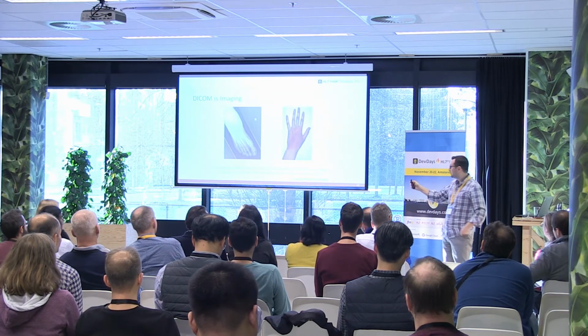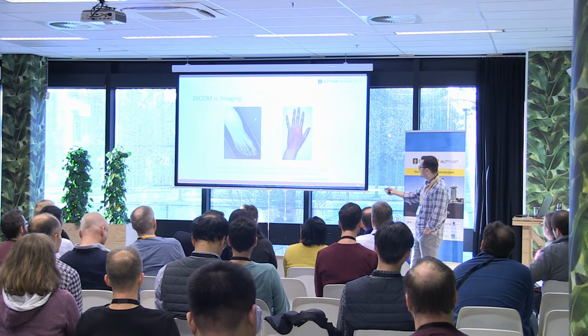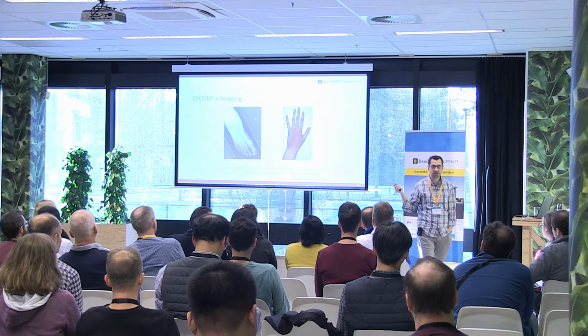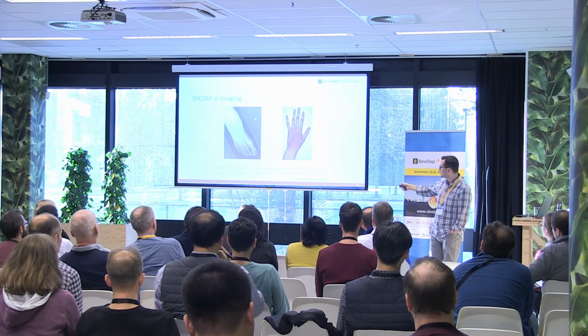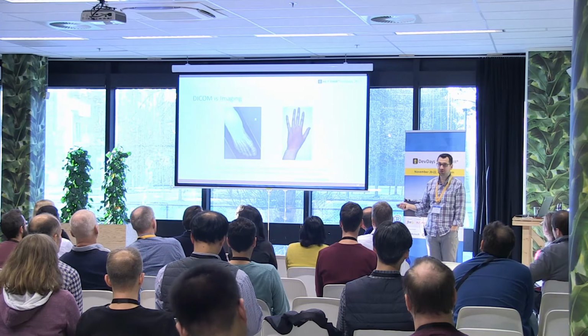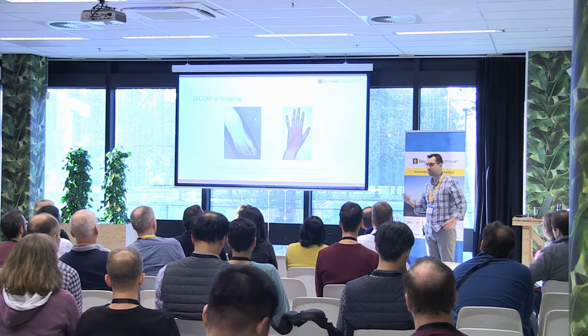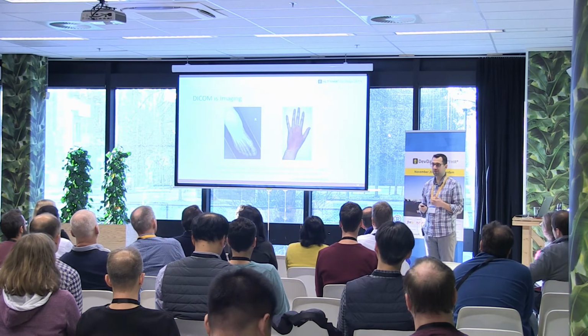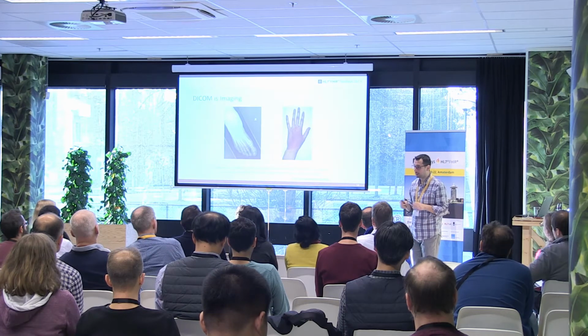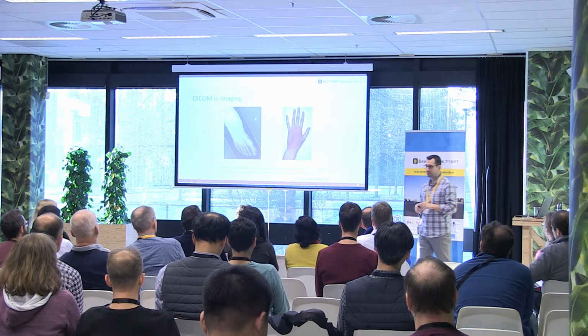But anyway, the thing with DICOM is, don't think of just your typical black and white X-ray and CAT scans. DICOM is also capable of capturing other things like this. And as you're going to see throughout the presentation, even the use cases for what can be put into DICOM are actually evolving. At some point in the presentation, we're going to talk about real-time video, like live video, which is pretty cool.